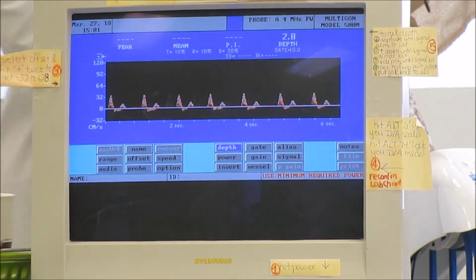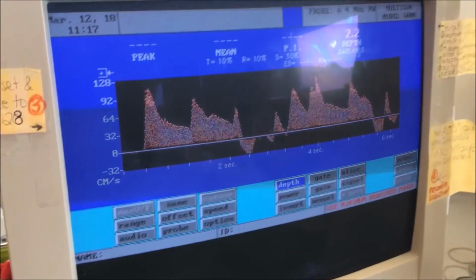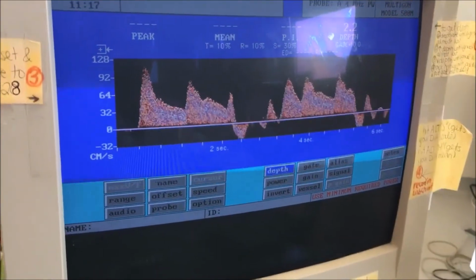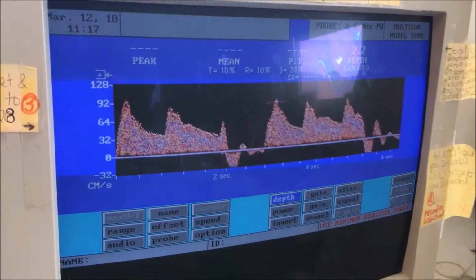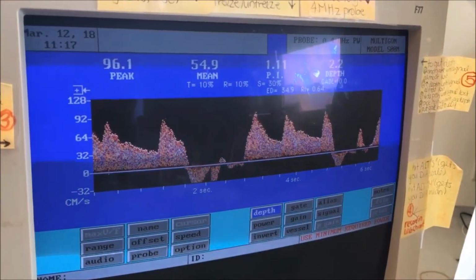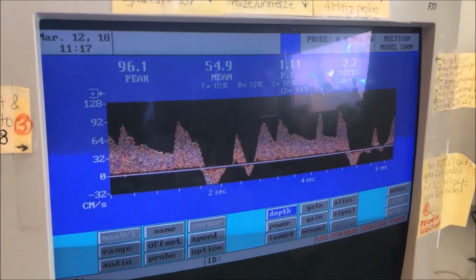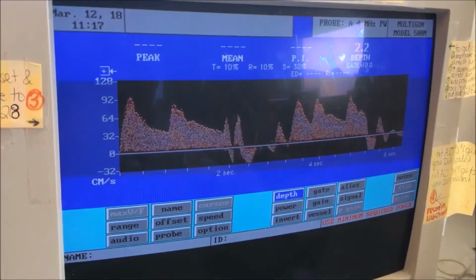As you can see, during rest, the graphical representation of blood velocity stays constant, with the amplitude wave being quite small. As you increase the amount of work that must be done, the blood velocity will increase as more blood must be delivered to the exercising limb. The current image was taken when the participant was contracting at his maximum capacity. As you can see, this is very different from the at-rest measures that were shown earlier.